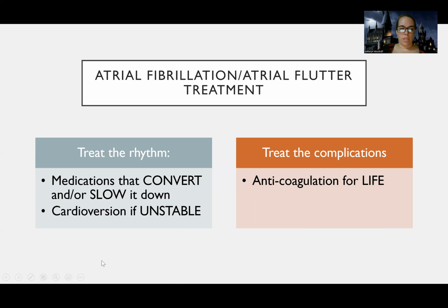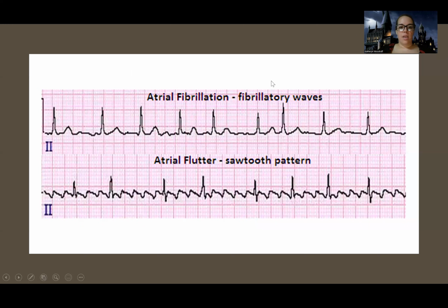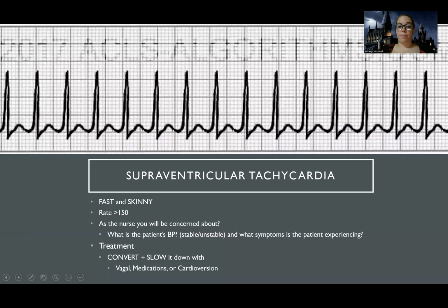So let's keep going. So here's that side by side, like I mentioned. Here's atrial fibrillation. You can see those fibrillatory waves, and we have flutter. And so you see the difference. These are kind of squiggly, whereas this one is that beautiful sawtooth pattern. Woohoo, so pretty. So yeah, they're different in the look, but again, we're not really trying to test you on the difference here because the treatment's the same. But just know there is a difference there.